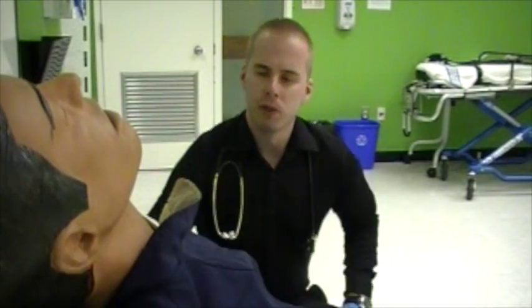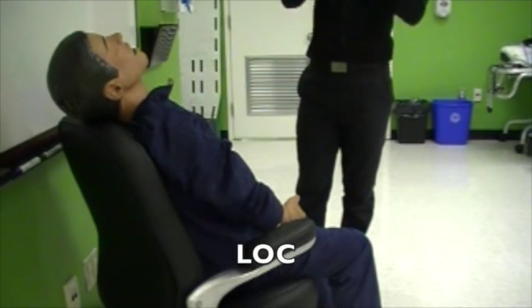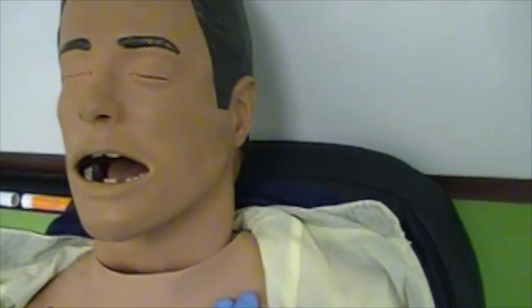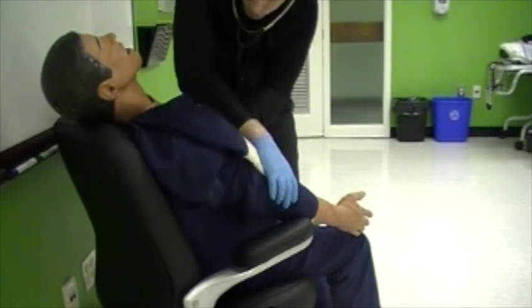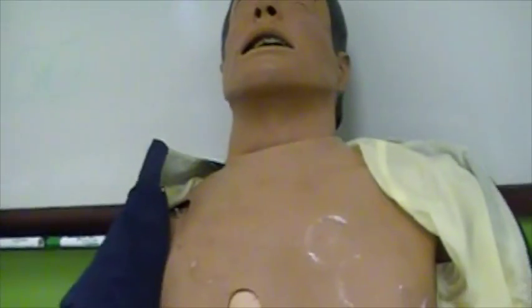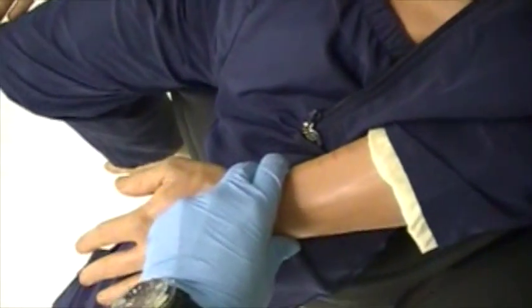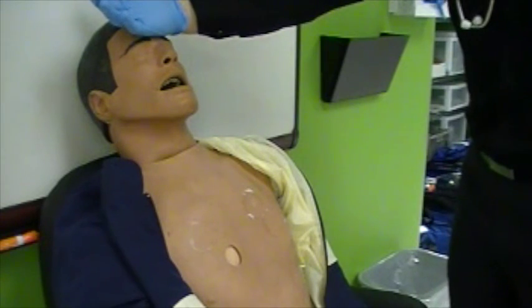Obtain a general impression. Approach the patient, obtain consent, and determine level of consciousness and for presence of a patent airway. Assess the patient's breathing by auscultating the apices bilaterally as well as the bases. Normal breath sounds are equal and clear bilaterally. Now assess for the presence of pulse at both the carotid and radial arteries. Assess to ensure they are equal and of adequate rate, rhythm, and strength.